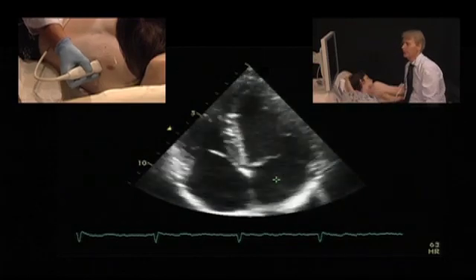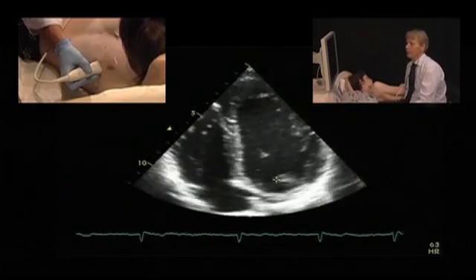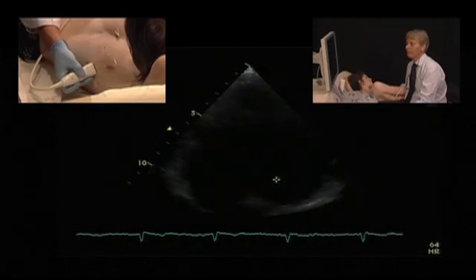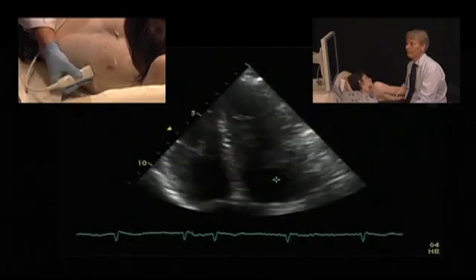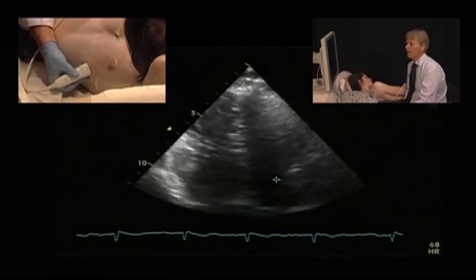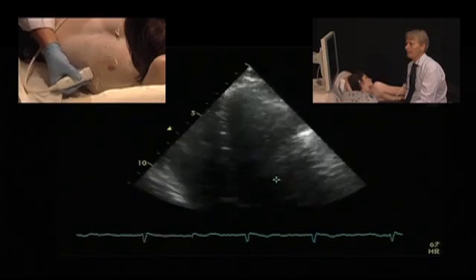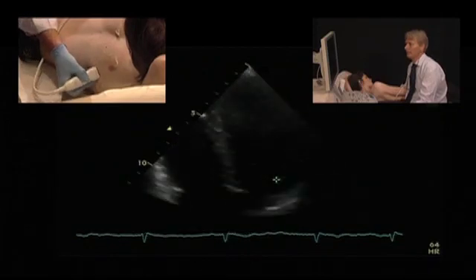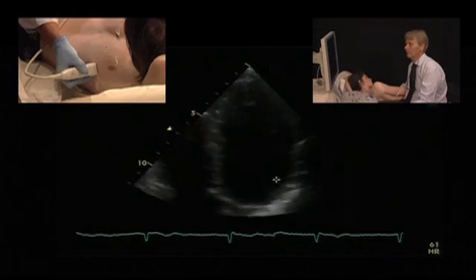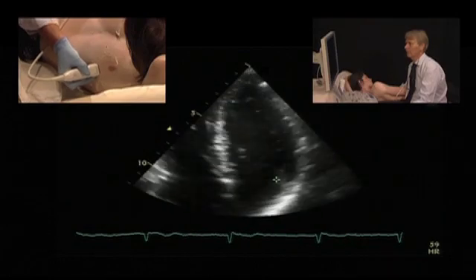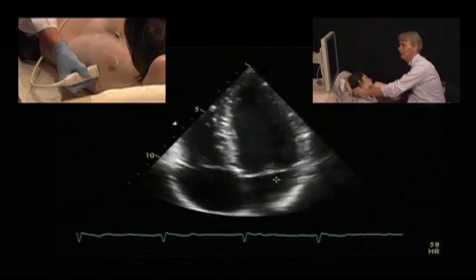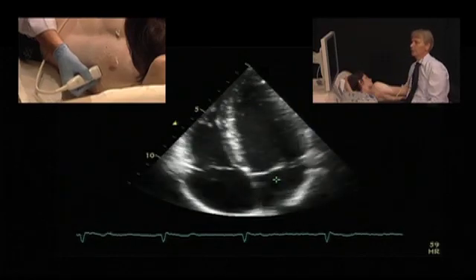How can you correct this? You can correct it by just moving more apically and laterally. This would probably be a better view — much less foreshortening.